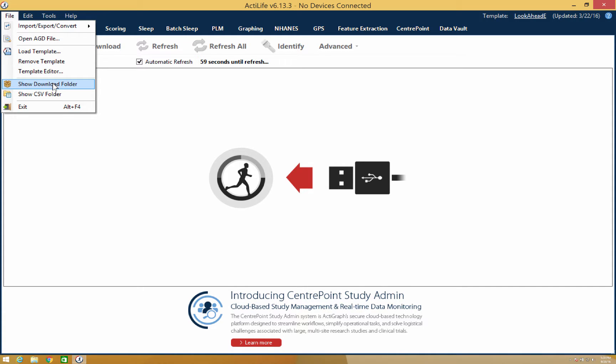The next two options, Show Download Folder and Show CSV Folder, simply help you locate where your files are being saved.